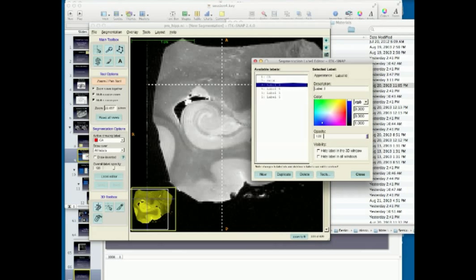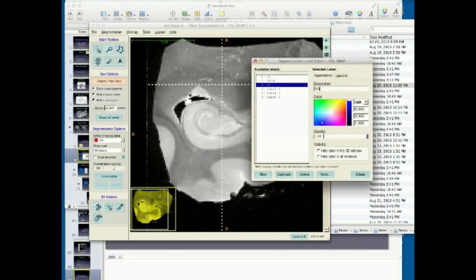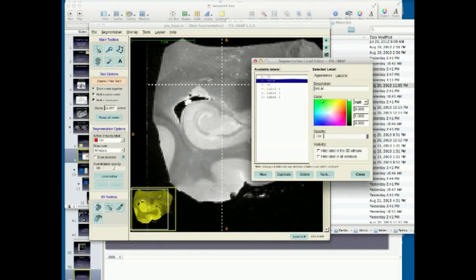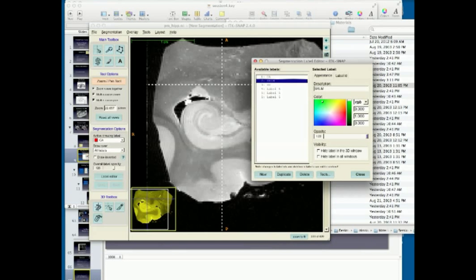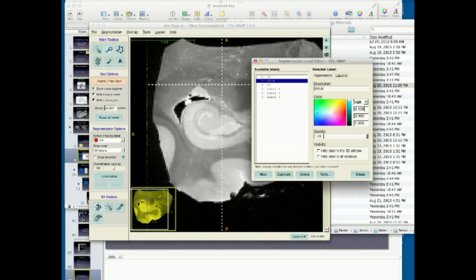Then we'll make the SRLM, which is the white matter separating the two, so we'll make that label 2, just change the name. And for label 3, we'll make that dentate. And here you can also change the color of the label. It doesn't really have an impact on it except for being able to differentiate them. So, you know, you don't want the labels to be too close in color because then it's easy to pick the wrong one.